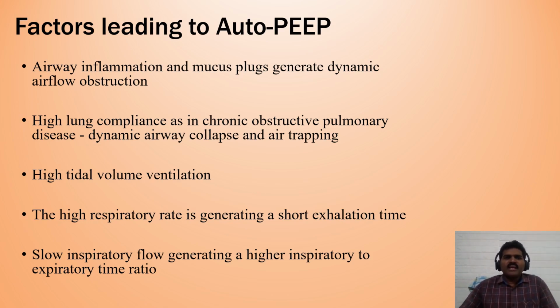In case of high lung compliance, as in chronic obstructive pulmonary disease, as I already told, dynamic airway collapse and air trapping occur with each breath, and the alveoli go on increasing until a pathological PEEP develops. High tidal volume ventilation, low time for exhalation, and slow inspiratory flow generating a higher inspiratory to expiratory time ratio, all these can lead to auto-PEEP.